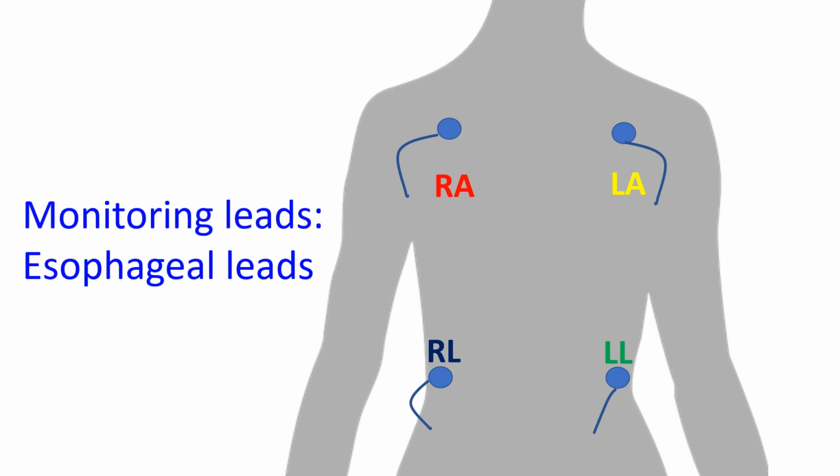The location of the leads on the chest depends on the type of patient. While locations on the front of the chest are available in chest pain patients, a surgical patient may require different locations depending on the location of operation and dressings. Leads placed in the food pipe may be used in some rare situations to decipher difficult heart rhythm abnormalities. These are known as esophageal leads.